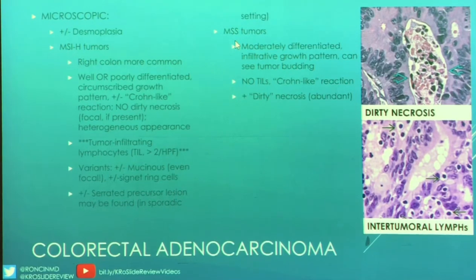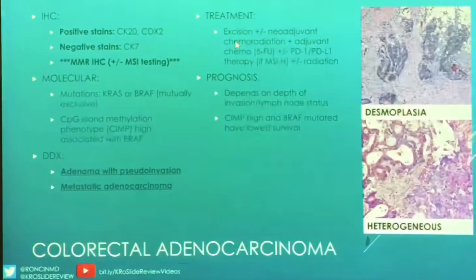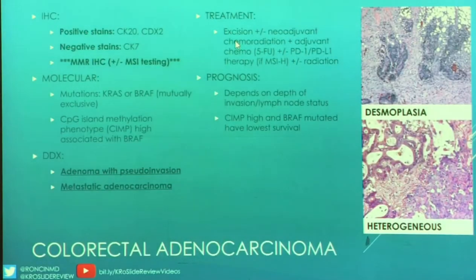Do I have a picture of that? I don't know. I don't know that the desmoplasia really shows it well. So if these pictures don't have it, I probably don't have one that actually shows it. But pretty much it'll be like, again, areas with tumor that doesn't quite make sense. Like it's definitely not a crypt that's involved.